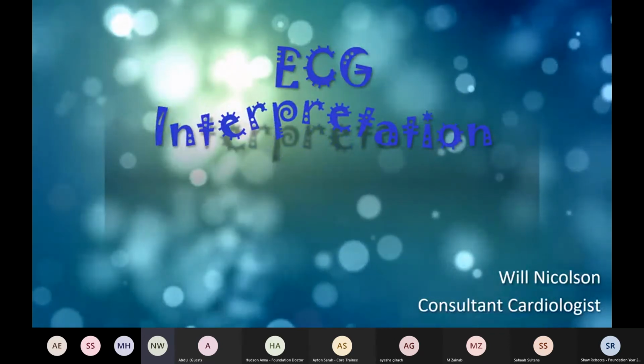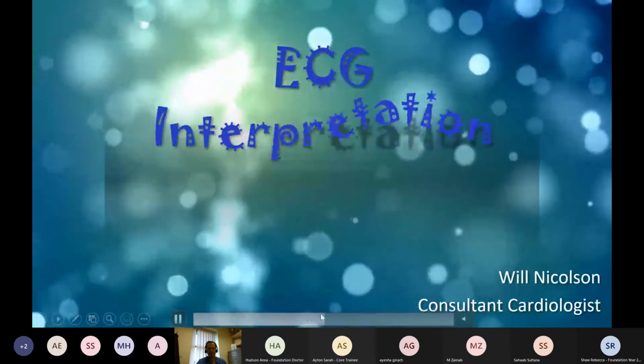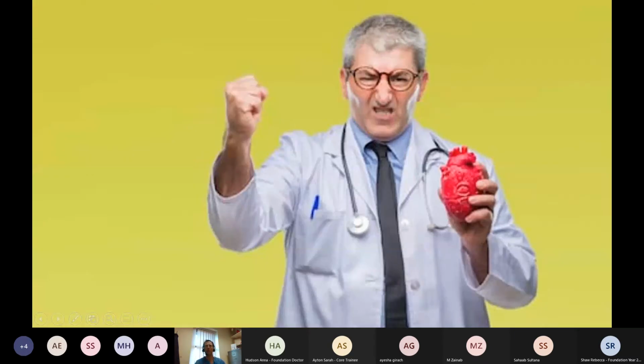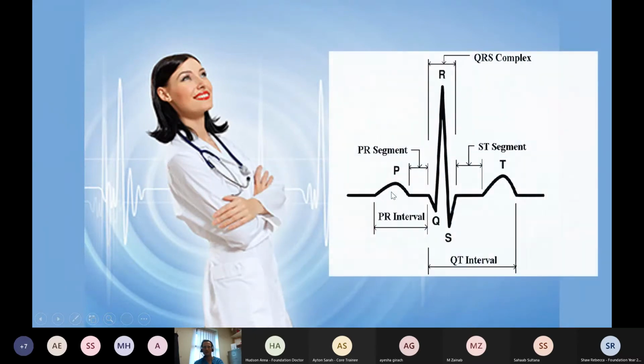I very much hope that as part of this presentation, you'll feel some of the joy and love that I feel for ECGs. It would be great to share some of that around because I think ECG is such a wonderful, simple investigation. So I'm hoping that I'm going to take you from this. Can you imagine a screwed up ECG in this gentleman's fist through to the promised land of blissful synergy with ECGs that this very impressive doctor has achieved.